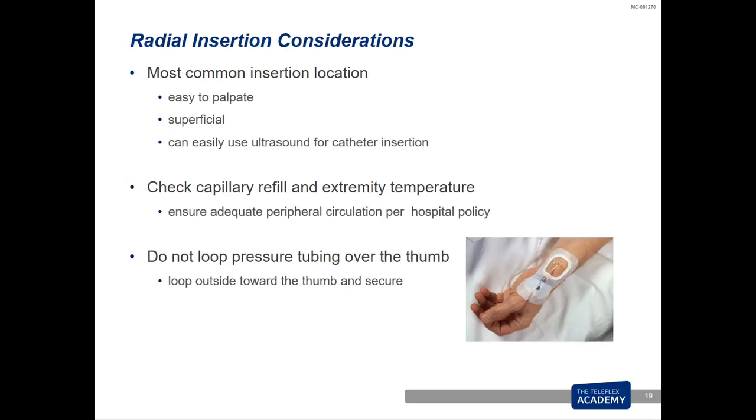Anytime a catheter is indwelling in a vessel, it actually takes up an inner portion of the vessel and reduces circulation in that vessel. So, for example, in the wrist, if you have a radial artery, you want to assess the capillary refill of the hand and distal pulses up to the catheter to ensure that you have good circulation. If the catheter was placed in the groin, you would want to do femoral insertion site inspection, but also assess the pulses in the foot of that extremity and compare those pulses, capillary refill, and extremity temperature to the opposite limb.